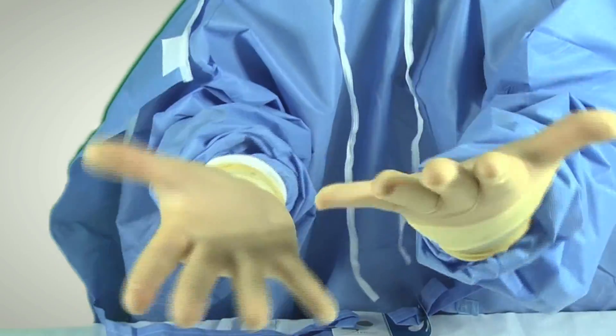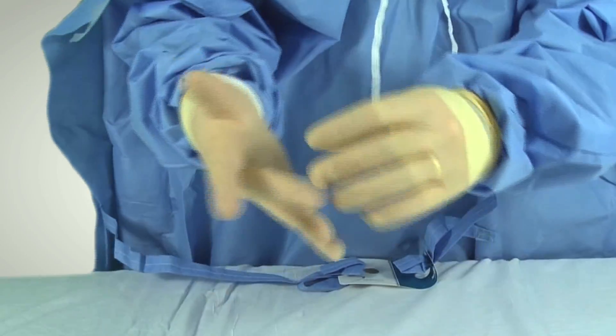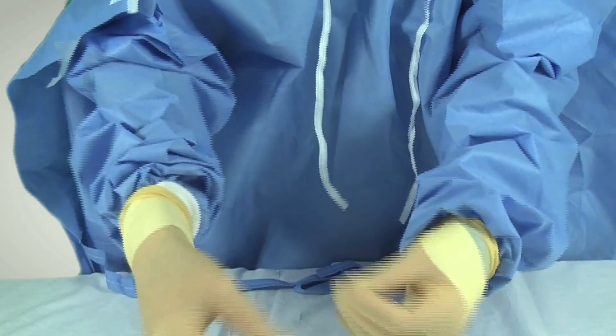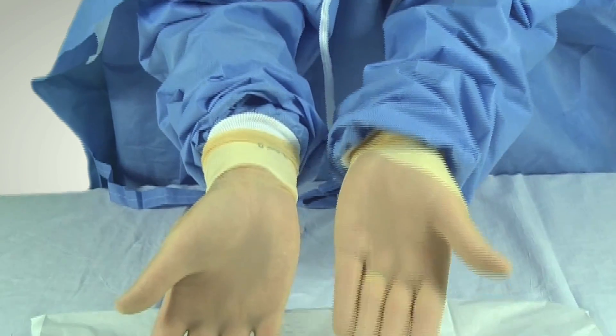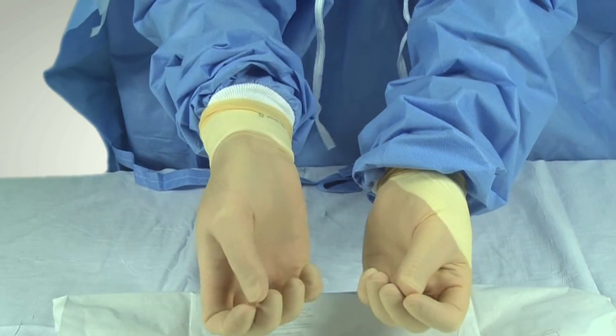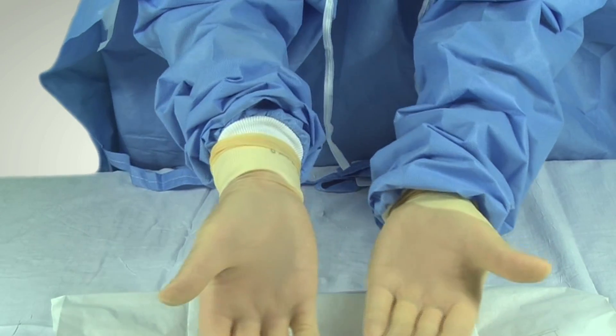So never did the fingers come out, and that's exactly how I did it. Now what I'm going to do is, I'm going to do this again with my bare fingers, so you see really what it is that I'm trying to do. Obviously, with the bare fingers and without the gown on, it's a mistake, but that will show you exactly the little detailed points I want to make.